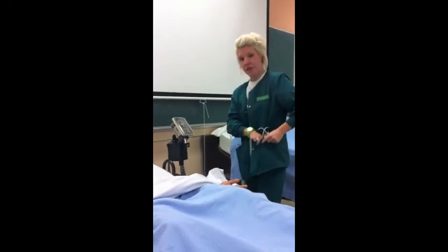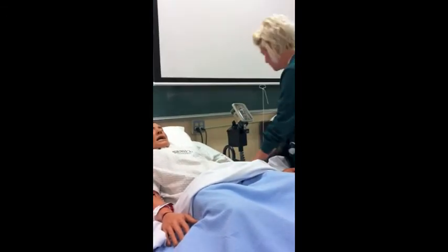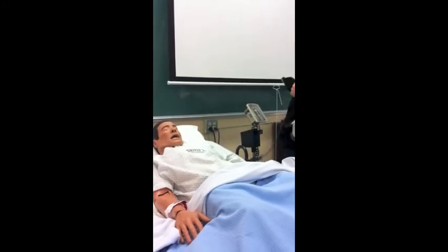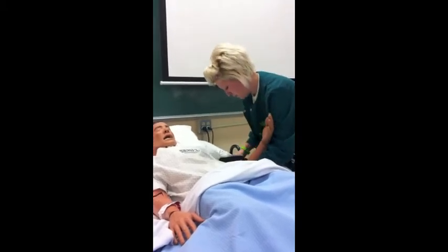And I'm going to be taking the patient's blood pressure. I'm going to locate the brachial pulse, and I'm going to position the cuff 1 inch above where I located the brachial pulse in the antecubital space.